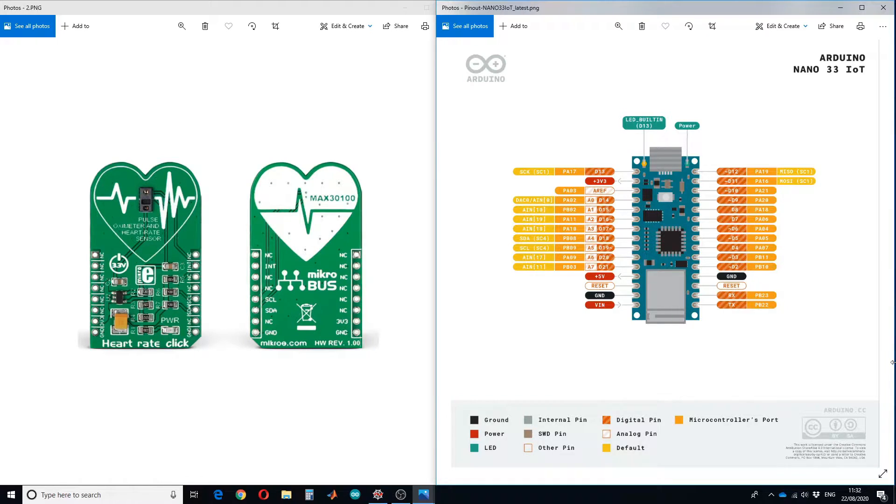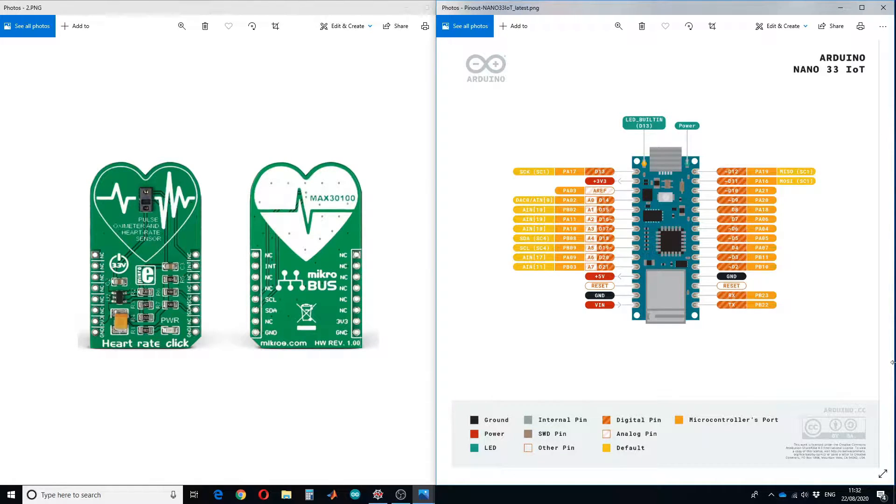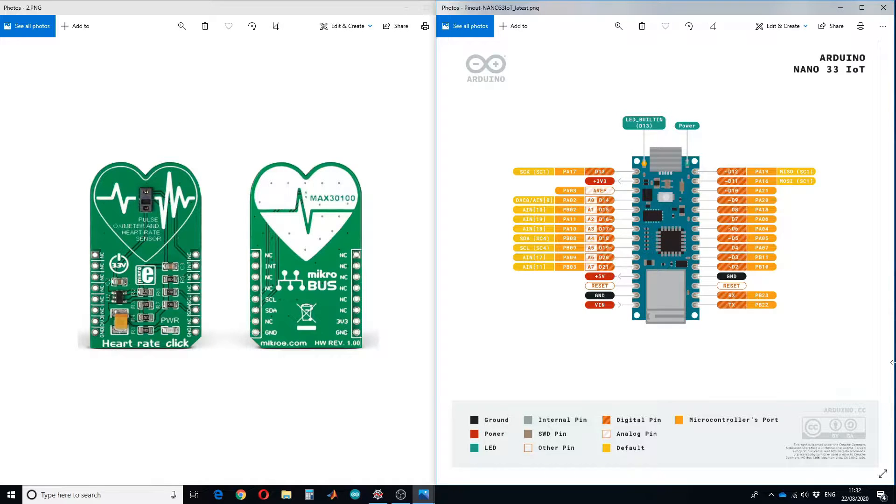Hello guys and welcome to a new tutorial. In this tutorial I'll show you how to design a heart rate monitor using Arduino Nano IoT board and MAX30100 board. MAX30100 board has a pulse oximeter and heart rate sensor.